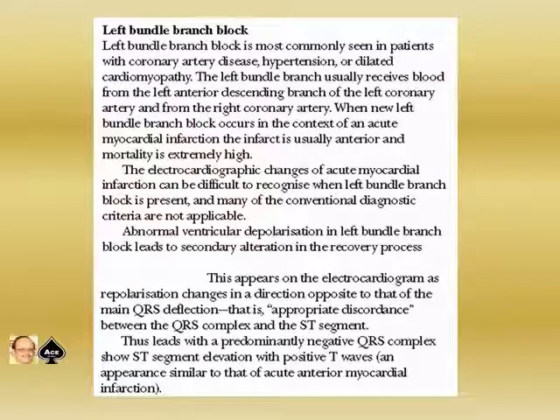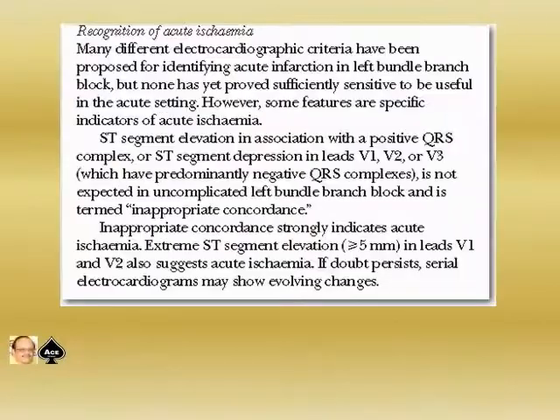Recognition of acute ischemia. Many different electrocardiographic criteria have been proposed for identifying acute infarction in left bundle branch block, but none has yet proved sufficiently sensitive to be useful in the acute setting. However, some features are specific indicators of acute ischemia.